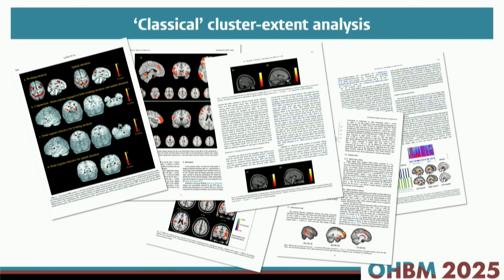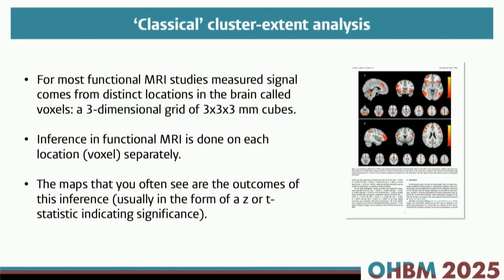In the early days of fMRI, most of the images that you see are brains with some blobs of activation, and these blobs are interpreted in terms of where they're located in the brain. And then we say, well, this task that we did activated regions in this area, and most likely this area does this sort of processing. And it goes, well, for everything.